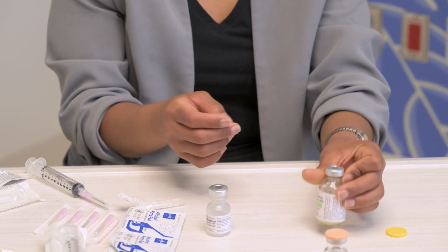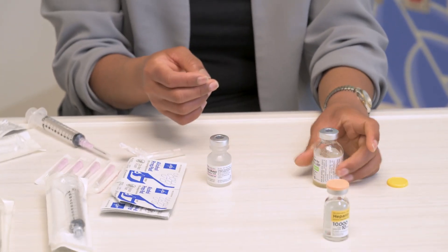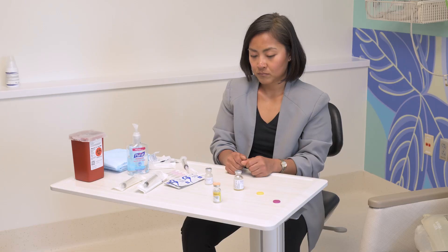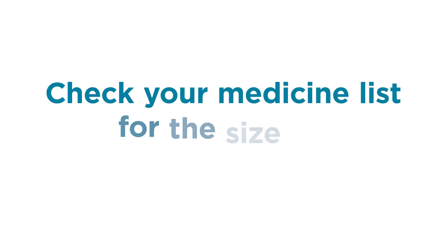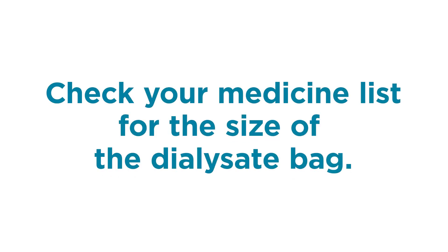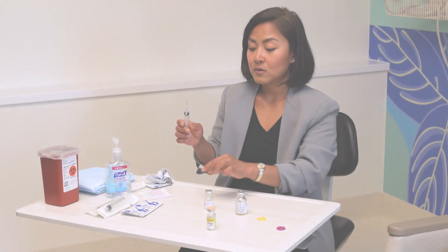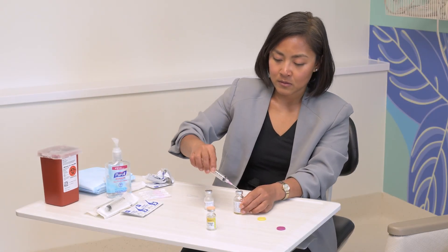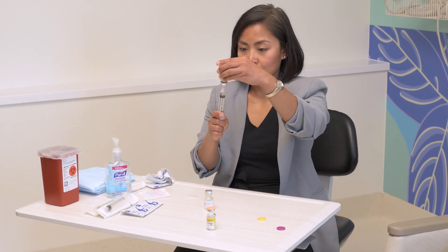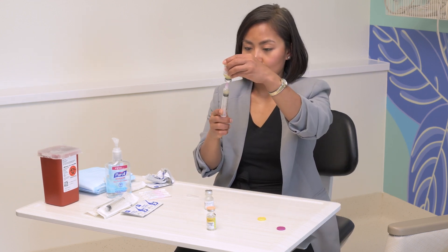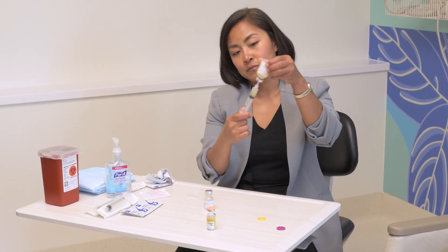Check your child's current medicine list for the amount of antibiotic to add to each bag. Your dose will depend on the size of the dialysate bag. This is important because the bag sizes can change often. Draw up the liquid antibiotic into the syringe to be added to the dialysate bag or ultra bag.